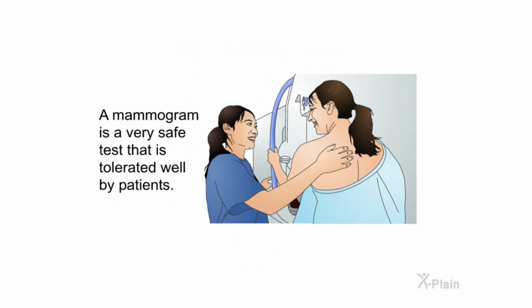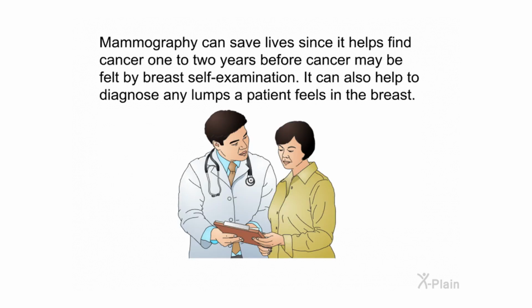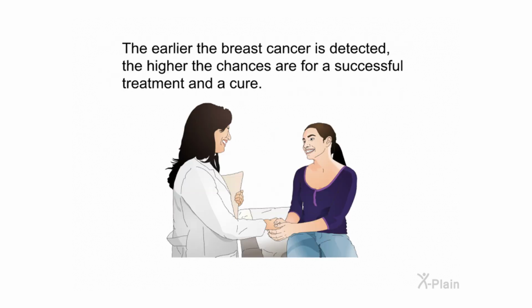Summary. A mammogram is a very safe test that is tolerated well by patients. Mammography can save lives since it helps find cancer 1 to 2 years before cancer may be felt by breast self-examination. It can also help to diagnose any lumps a patient feels in the breast. The earlier the breast cancer is detected, the higher the chances are for a successful treatment and a cure.